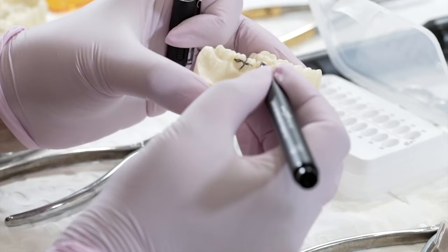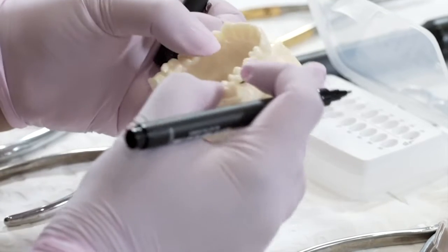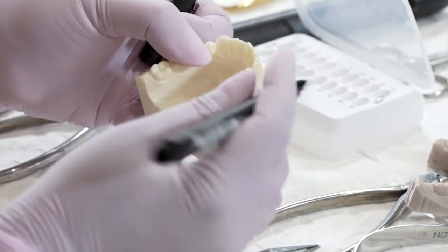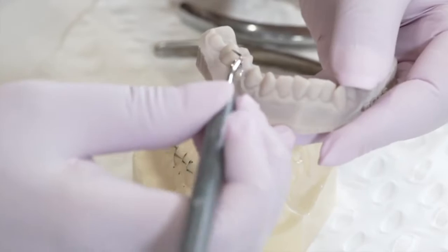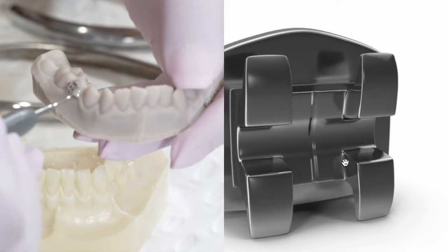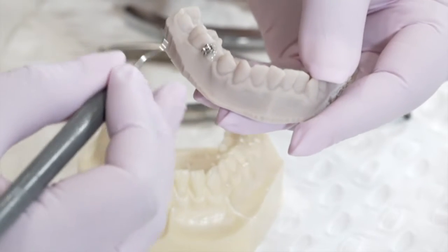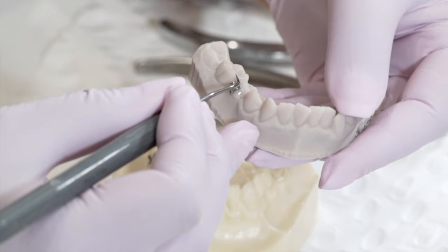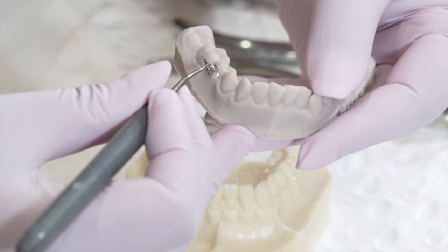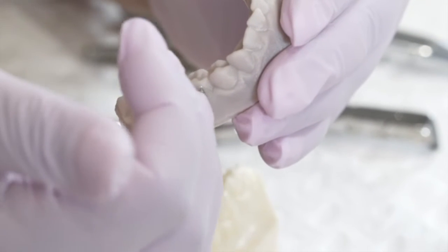I'll put a horizontal axis here. As I go along, I'll be looking from the occlusal side. This tooth is a bit rotated so you need to look from a few different angles. You want to make sure the marginal ridge — both mesial and distal — are parallel to the horizontal axis, and also check that the bracket height is correct. Since this is a growing child with erupting teeth, I'll place the bracket a bit more gingival, ensuring the marginal ridges are parallel to the horizontal.